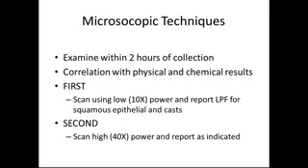Microscopic techniques: examine within 2 hours of collection. There should be correlation of the physical and chemical results. It's important to do the physical examination first and then the chemical results. We cannot do a chemical exam after the microscopic portion has been done.